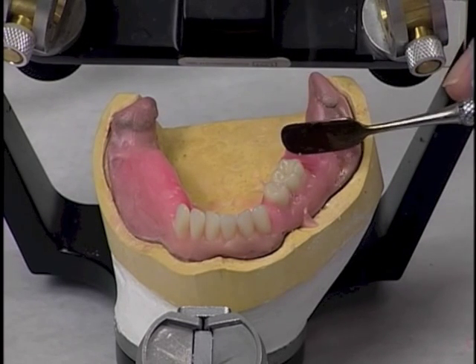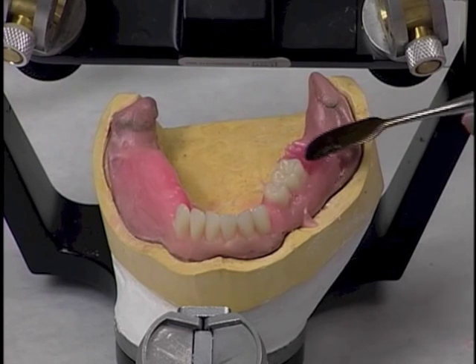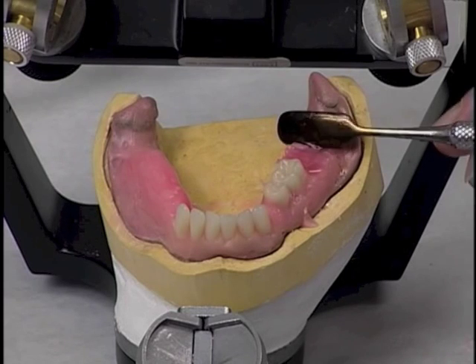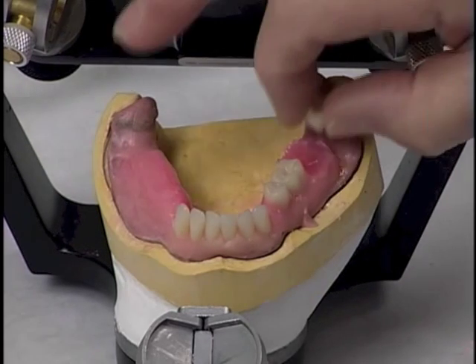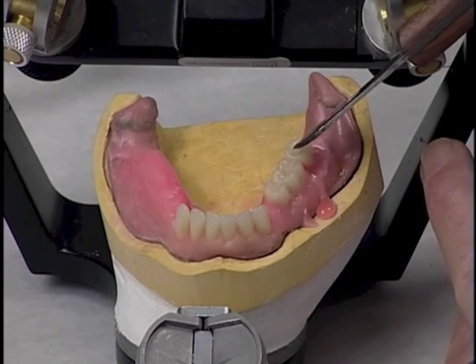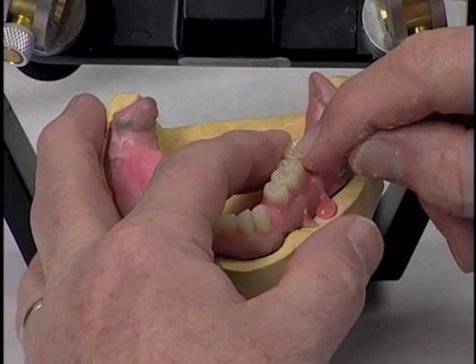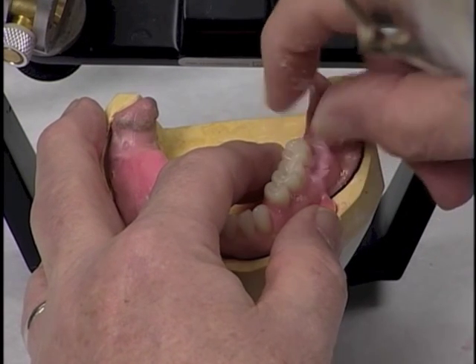And so we pull the wax again. The wax is nice and soft, so we won't have any problem placing the tooth. And we take our second molar now, and we're going to make sure as we arrange that tooth that the marginal ridge of this second molar is going to be even with the distal marginal ridge of the first molar, which means it needs to be down just a little bit there.